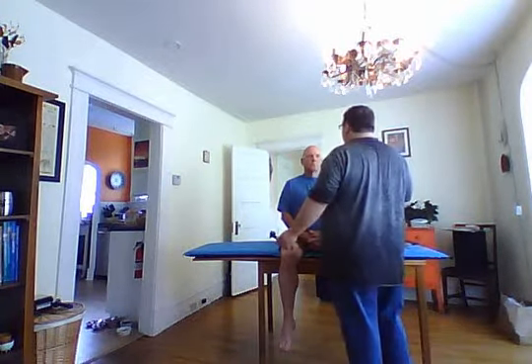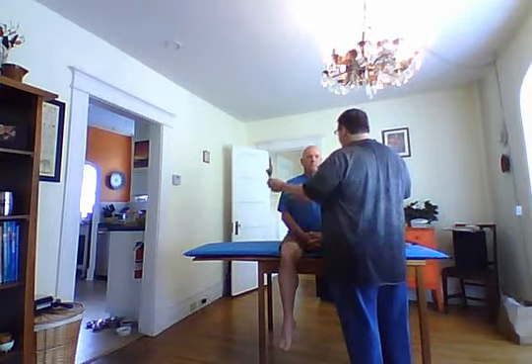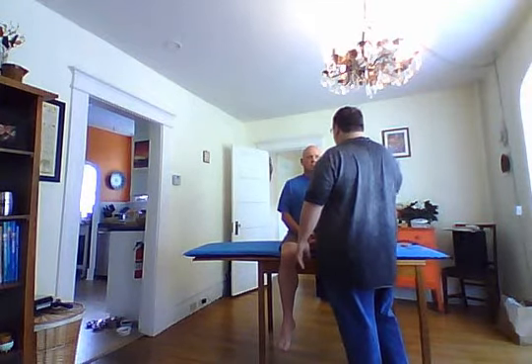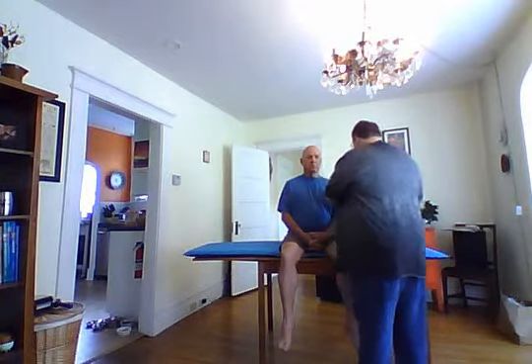Now that I've done that, I'm going to use my otoscope as my light source to check pupil reaction. So if you would just hold still, I'm shining my light to look for the direct pupil reaction and the consensual reaction on the opposite side. Direct and consensual. And his pupils are equal and reactive to light.